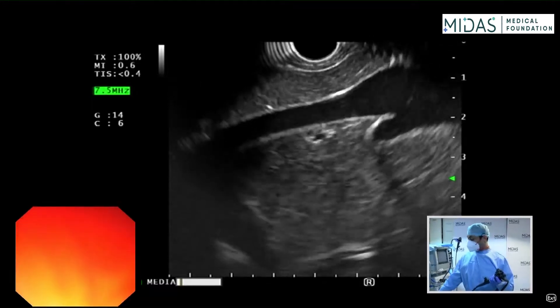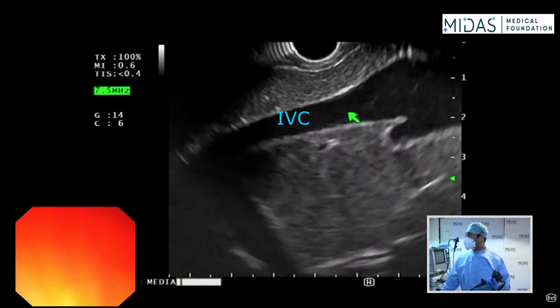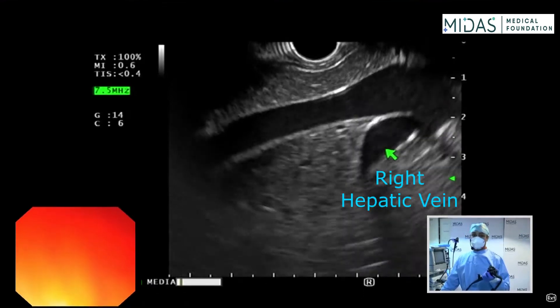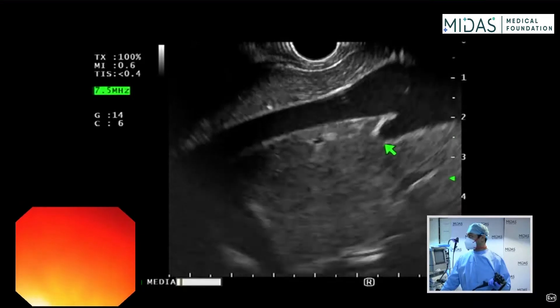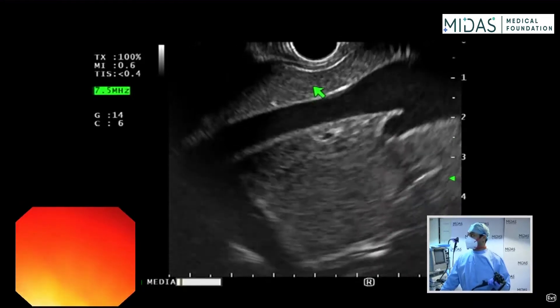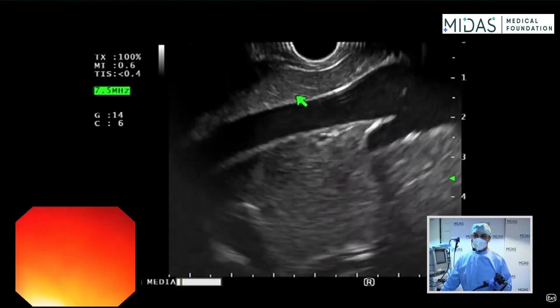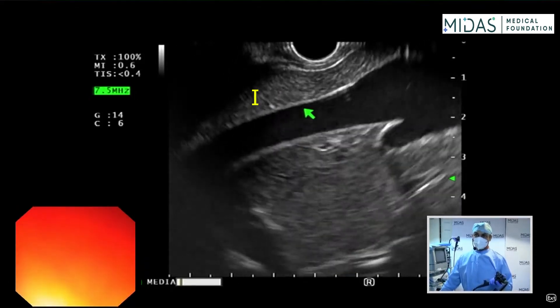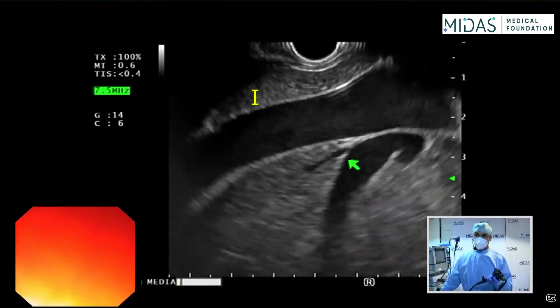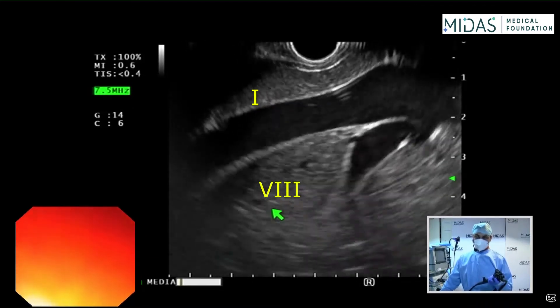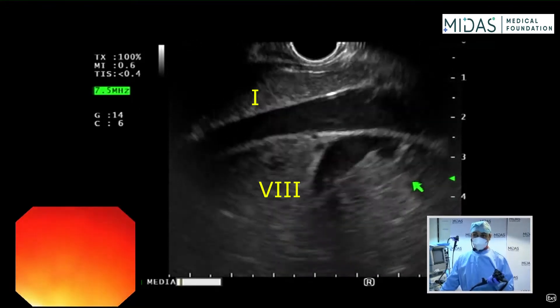What you're looking at on the screen is the inferior vena cava and the right hepatic vein, with a wide mouth opening inside the IVC. The segment of the liver between the transducer and the inferior vena cava is segment one. Between the inferior vena cava and the right hepatic vein is segment eight, and below the right hepatic vein is segment seven.